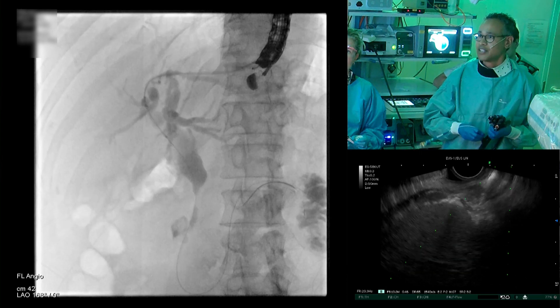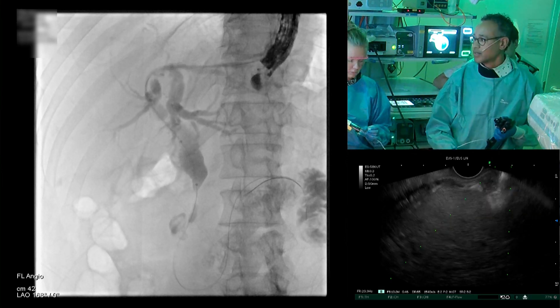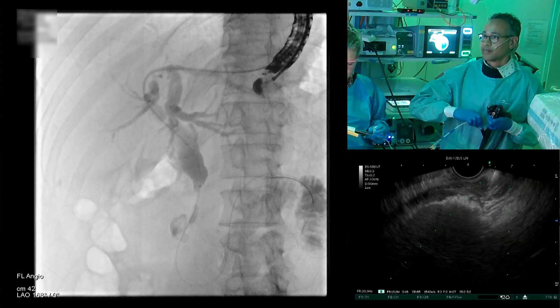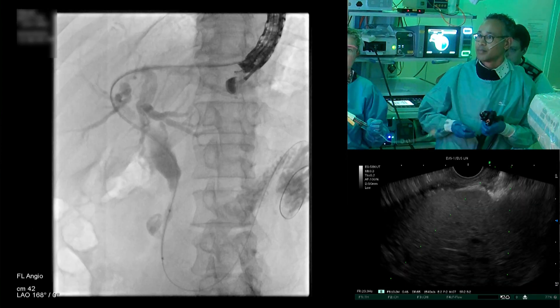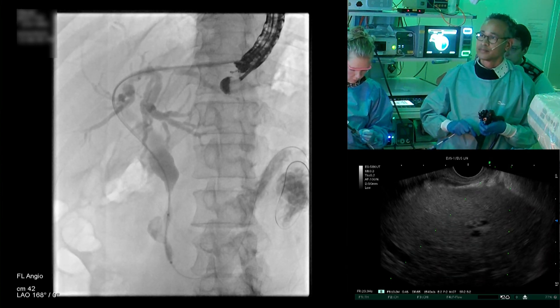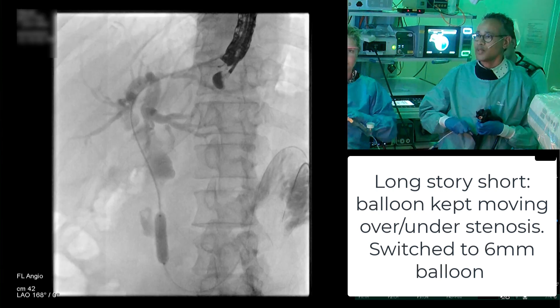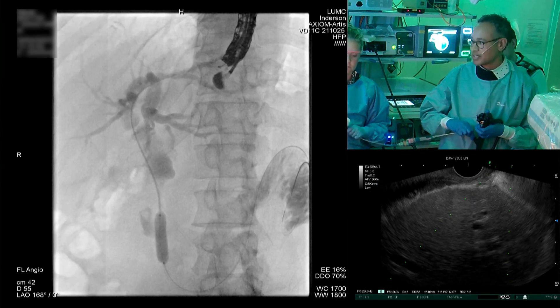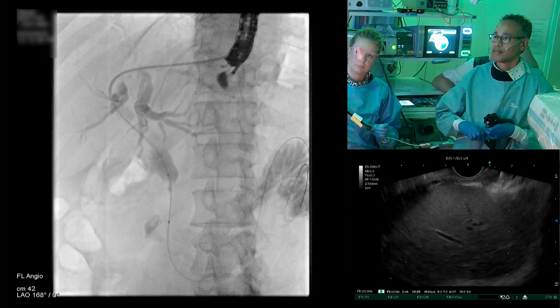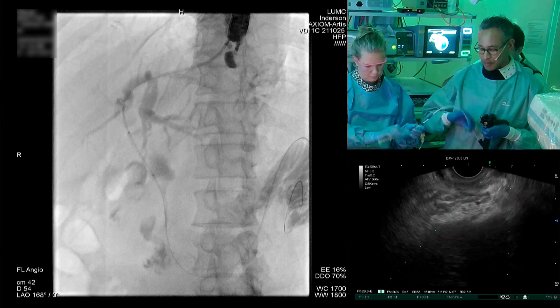We're introducing the dilation balloon through the stenosis — it's quite firm, so we really have to keep the endoscope fixed to the gastric wall. We're passing through, but I think it's now past the papilla. Please start inflation. It's a little bit past the papilla. I'm going to exchange for a 6mm balloon and use this 10mm dilation balloon for post-dilation once the stent is in place. We're now going to pull back and go for stent placement in an anterograde fashion.